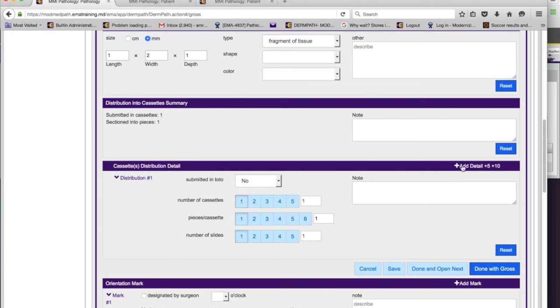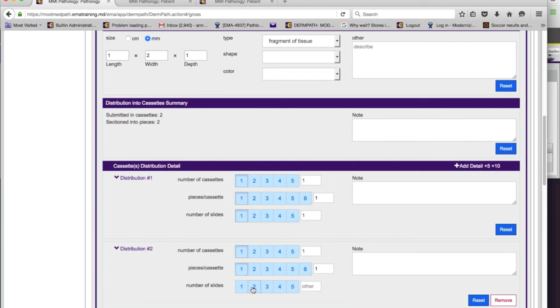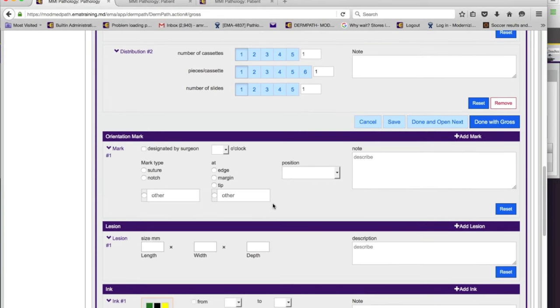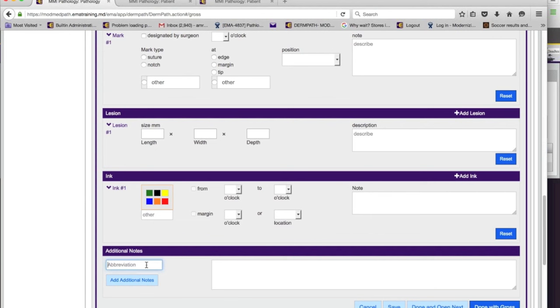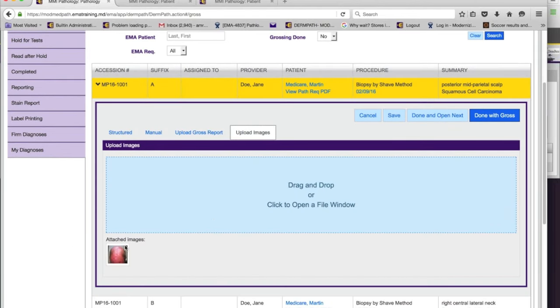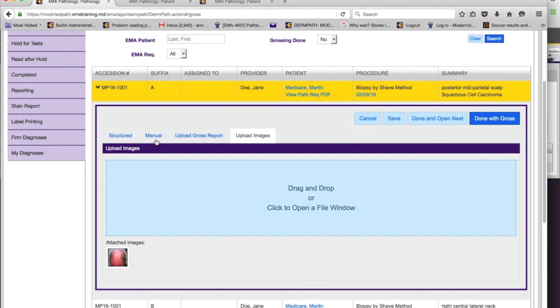I can say my first cassette has one piece and one slide, and add another cassette with one piece and one slide. You can say 'done and open next,' which opens the next case for you. You can also add orientation mark or inking. We have the concept of macros or abbreviations — you can use them here to insert a standard statement. Here are the images from the virtual exam room: if the dermatologist took pictures, they're available for you here in the module and you can click on them to see the picture.